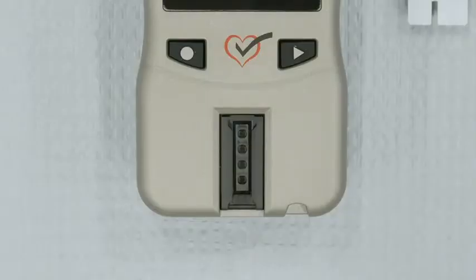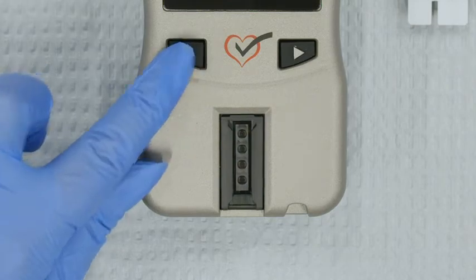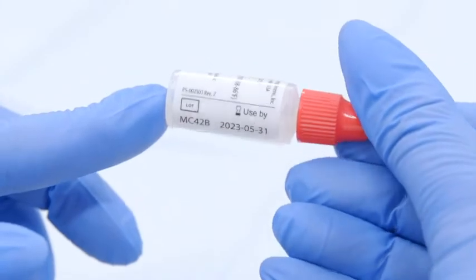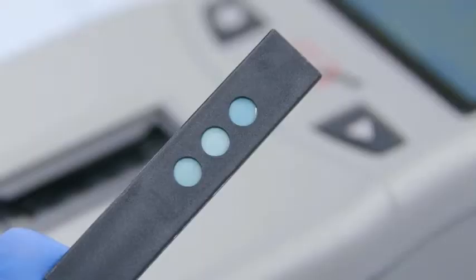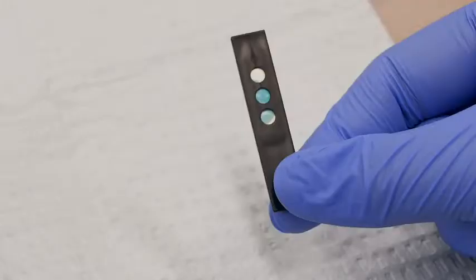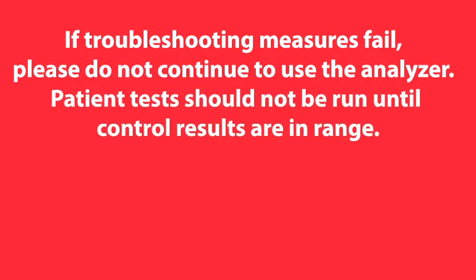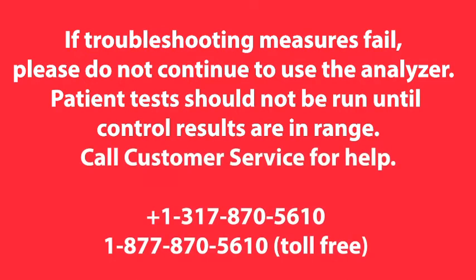If your level 1 results are within range, press Enter to move on to the level 2 control test. Use new test strips and the level 2 vial of control solution. If your results are not within range, check the back of the lipid panel test strip to make sure that the three circles are completely colored. If they are not completely colored, you might not have applied enough control solution. See the quality control testing section in the CardioCheck Plus version 1.12 user guide for more troubleshooting tips. If troubleshooting measures fail, please do not continue to use the analyzer. Patient tests should not be run until control results are in range. Call customer service for help.